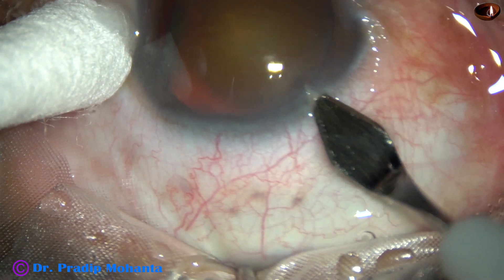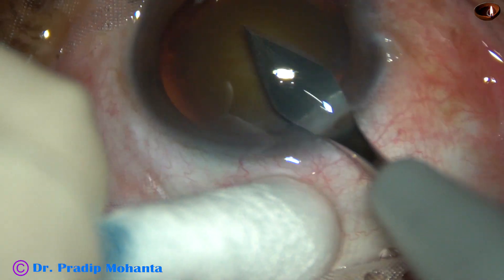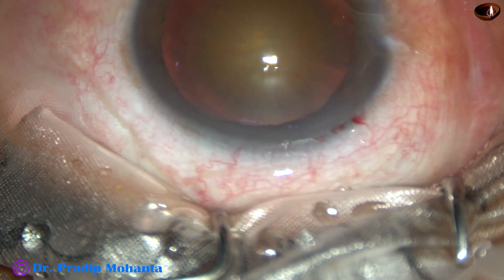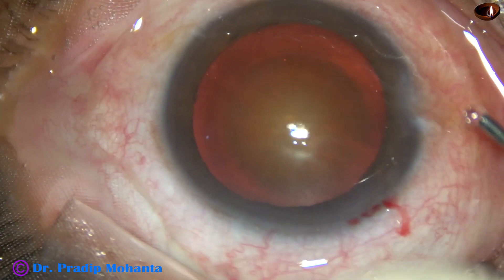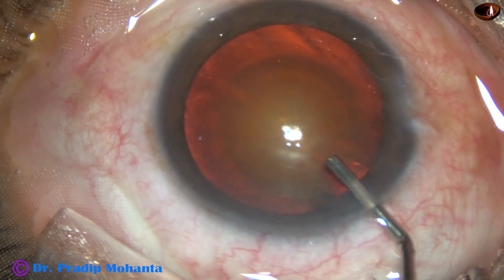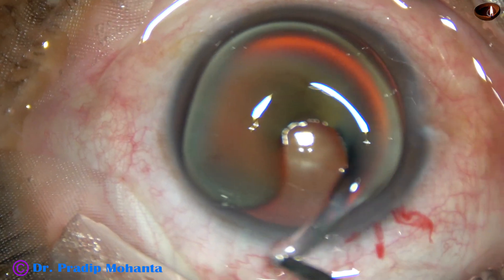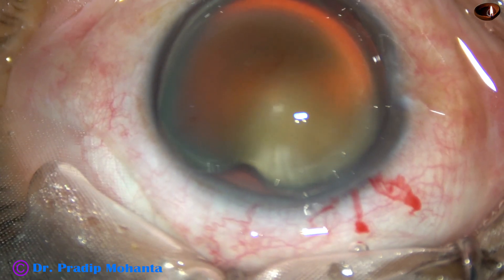This is the main incision with a 2.8 mm keratome on the posterior aspect of the limbus. 2% hydroxypropyl methyl cellulose is injected into the anterior chamber and applied over the cornea for better visibility.